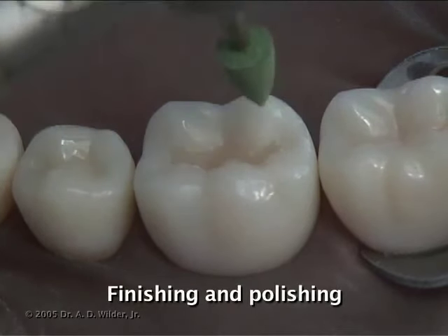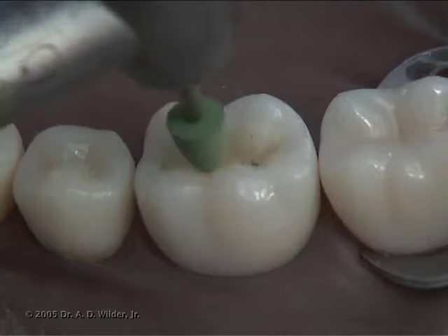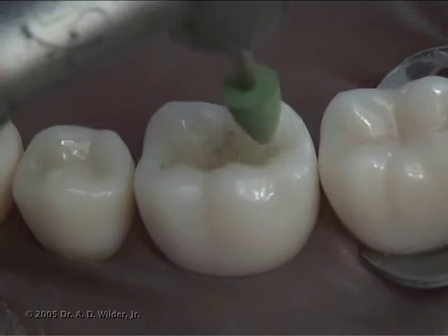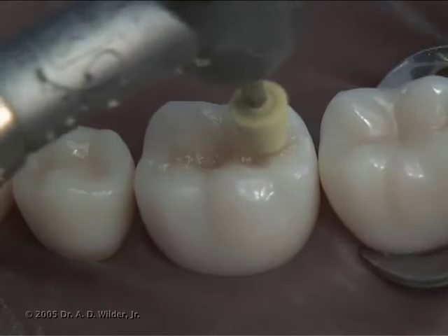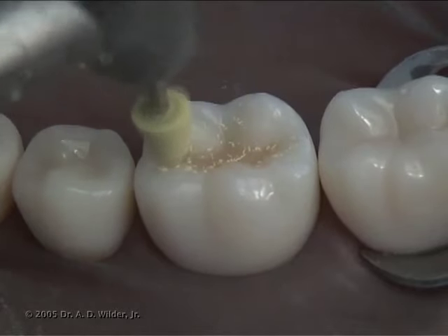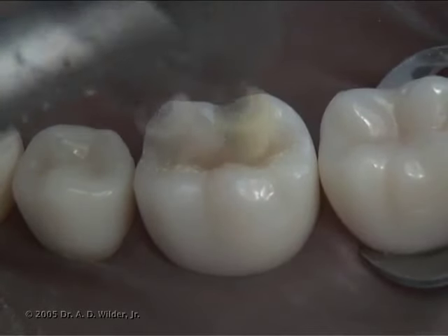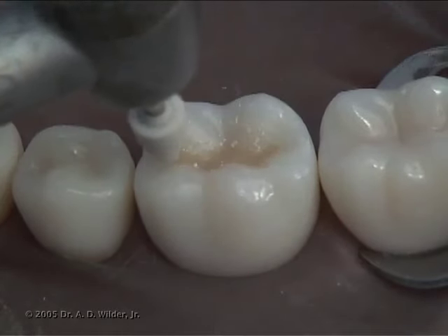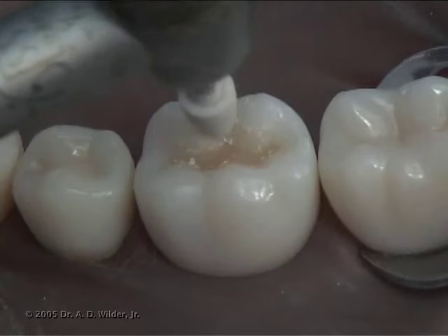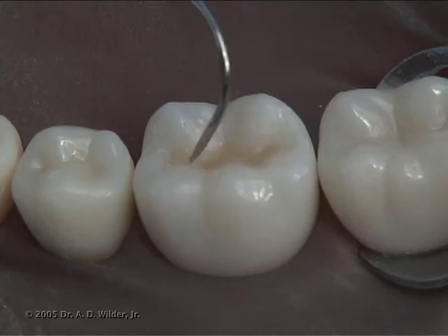Finally, you can finish and polish the restoration with a silicon-impregnated rubber polishing point. Green to yellow, and then to white, is the typical coarse to fine Jiffy polishing system. You can check one last time for flash, of course after confirming that the occlusion is satisfactory for the patient.